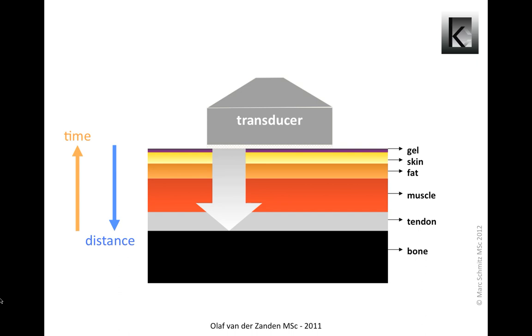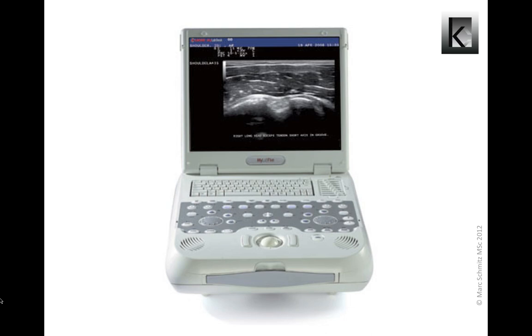The transducer is an essential element of the ultrasound equipment responsible for generating an ultrasound beam which is sent into the body, going through various soft tissue layers like skin, fat, muscle and tendon. Bone is hard and can't absorb the ultrasound beam, so the bone will reflect the beam back. The transducer detects the returning echoes and sends the signal to the ultrasound system where all information is processed by the software. After processing, the image can be seen on screen. The whole process of sending, receiving and processing happens so fast that there is no delay — all structures can be scanned and visualized in real-time.